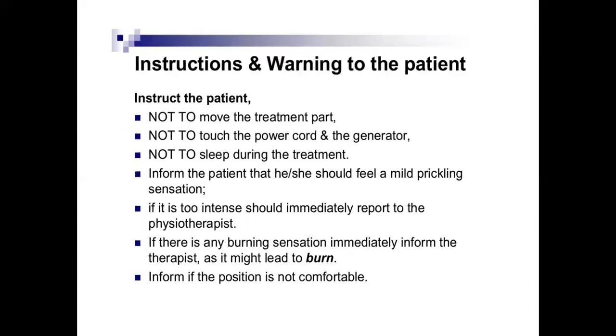Instruction and warning to the patient. Instruct the patient not to move the treatment part and not to touch the power cord and the generator. Not to sleep during the treatment. We inform the patient that she should feel a mild prickling sensation. If it is too intense, she should immediately report to the physiotherapist. If there is any burning sensation, immediately inform the therapist as it might lead to a burn. Inform if the position is not comfortable.